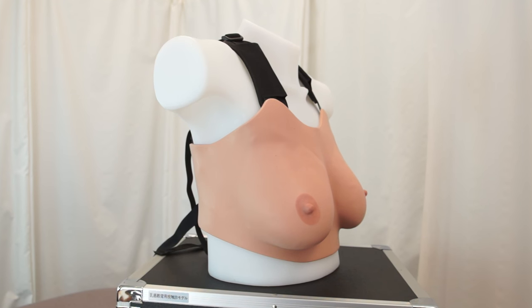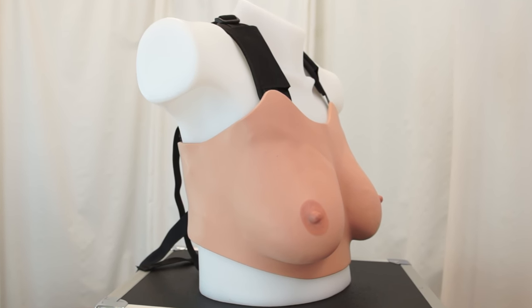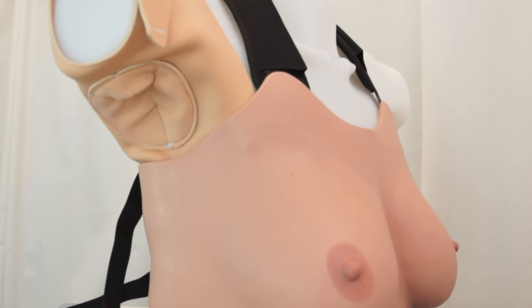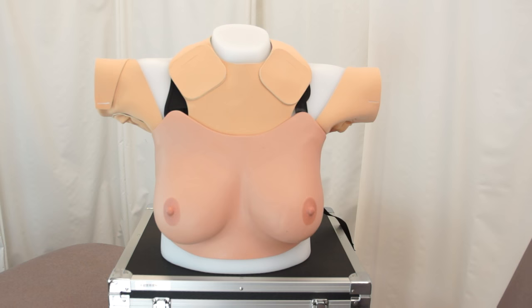When used on the torso, the breast models can be augmented with axillary node simulations to allow users to see what spread of the cancer beyond the breast to the lymph node would feel like. In addition to the axillary nodes, the advanced kits also come with simulations for the supraclavicular lymph nodes.